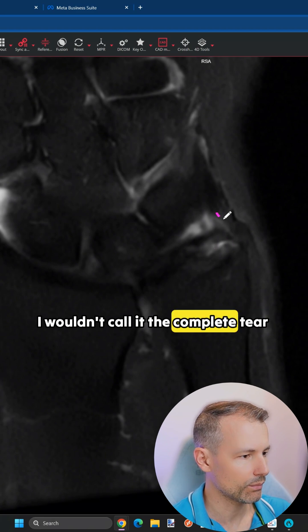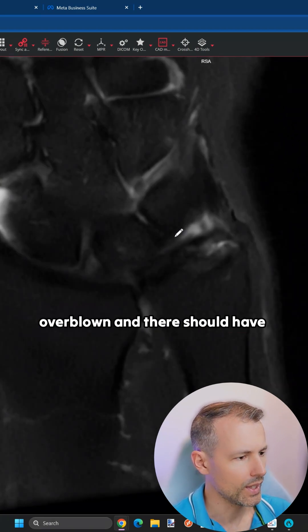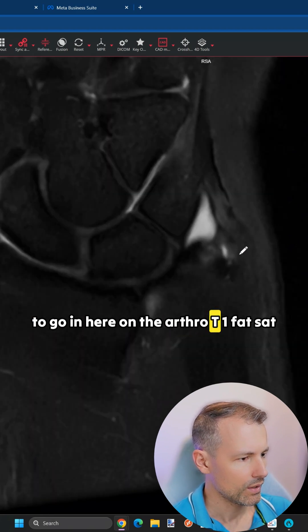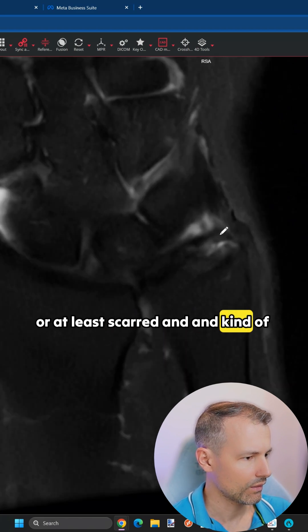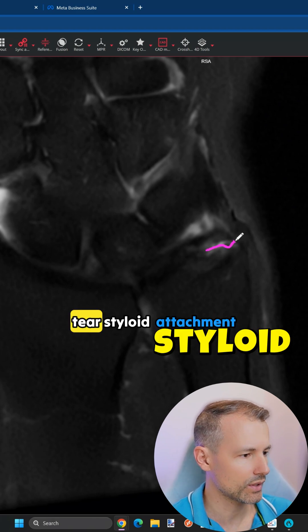I wouldn't call it a complete tear, otherwise I would have suspected the contrast to go in, because it was quite overblown and there should have been enough pressure to go in here on the arthrogram T1 fat-sat — and that's not the case. So some of these fibers might still be intact or at least act as a guard and prevent the contrast from communicating. So I would say high-grade partial tear of the foveal attachment.